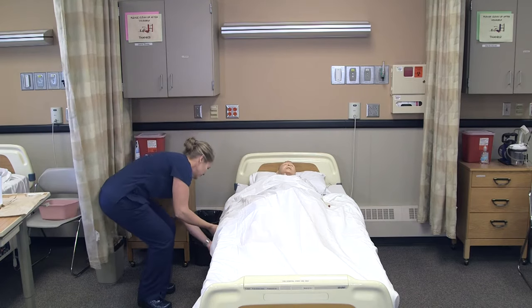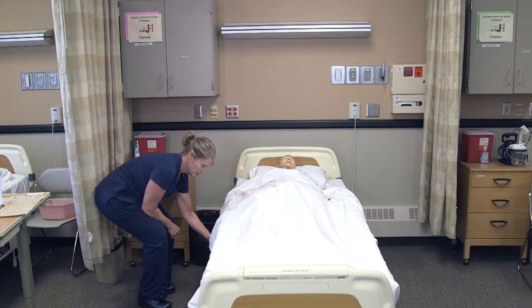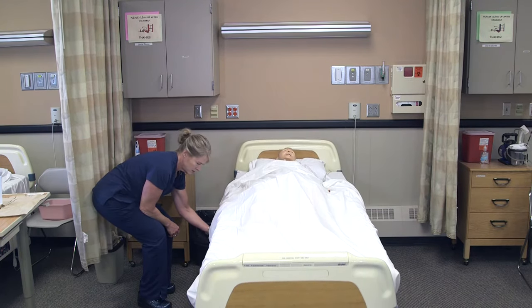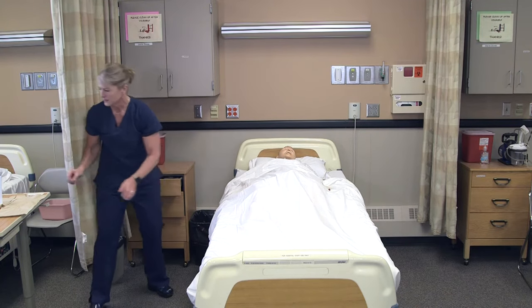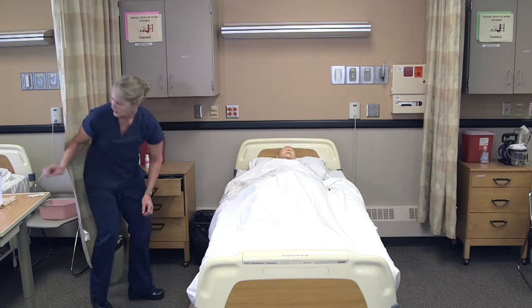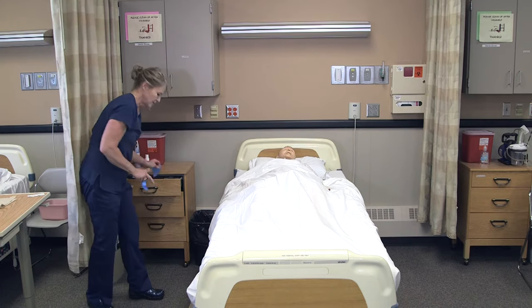I'm going to raise your bed up a little bit so the catheter bag doesn't touch the floor. I could also, if needed, raise the side rail and put the bag there. I'm going to put a barrier down on the floor and the graduate here, and get my gloves on.